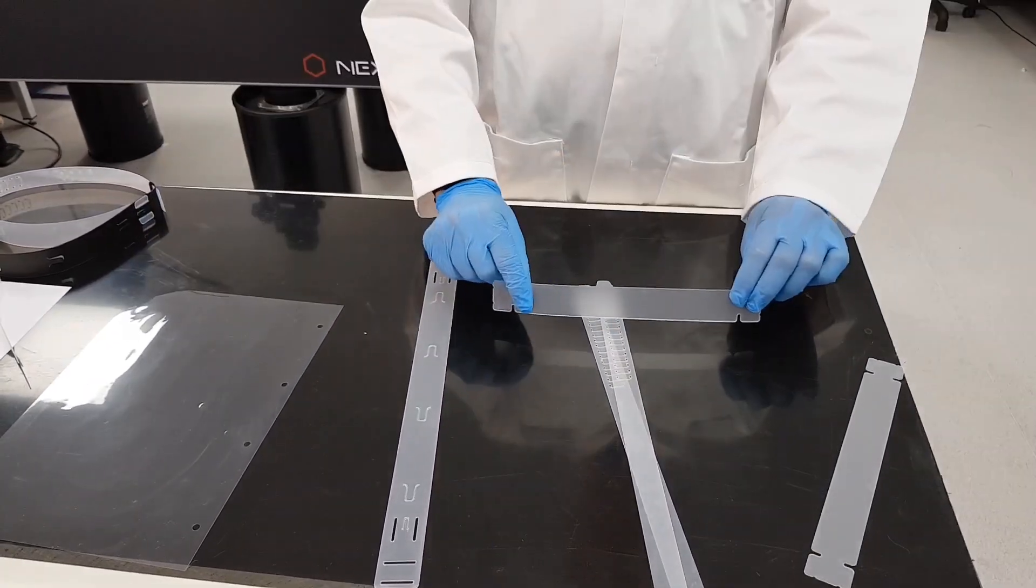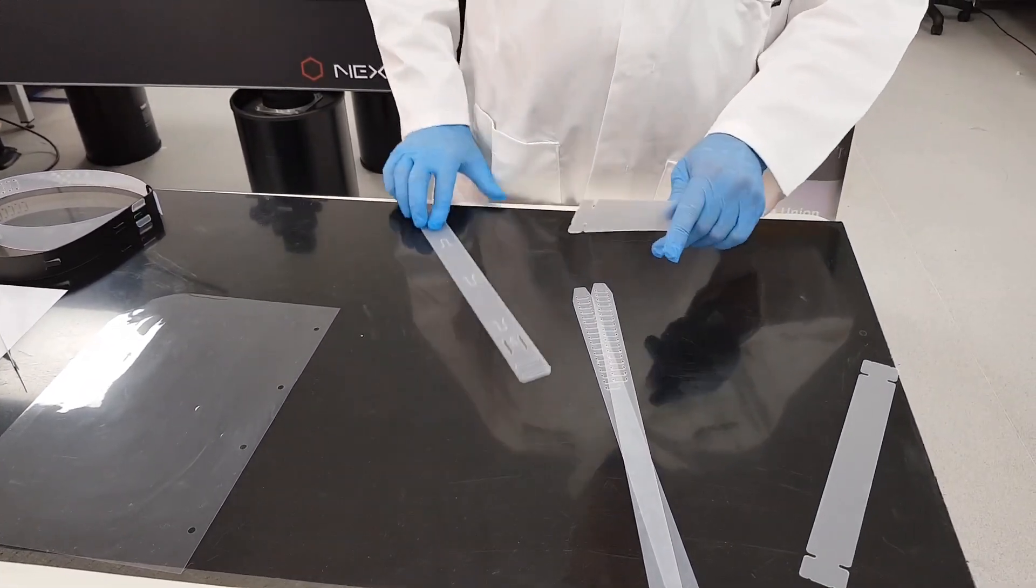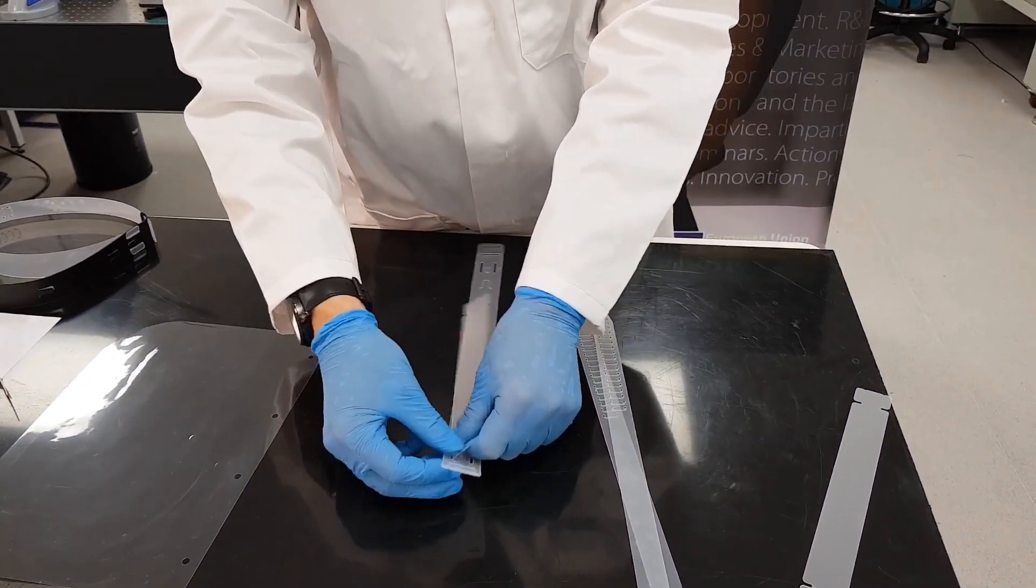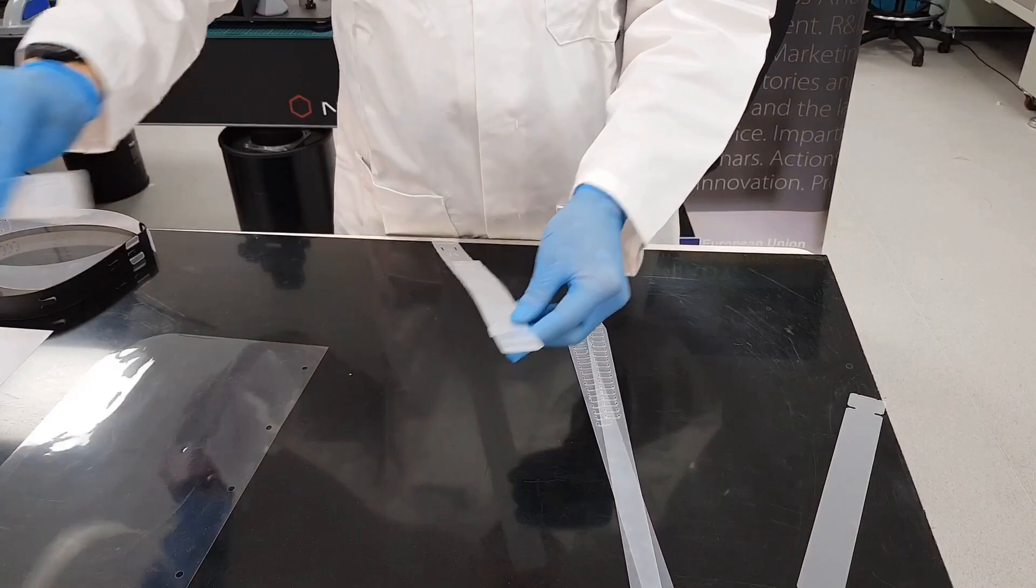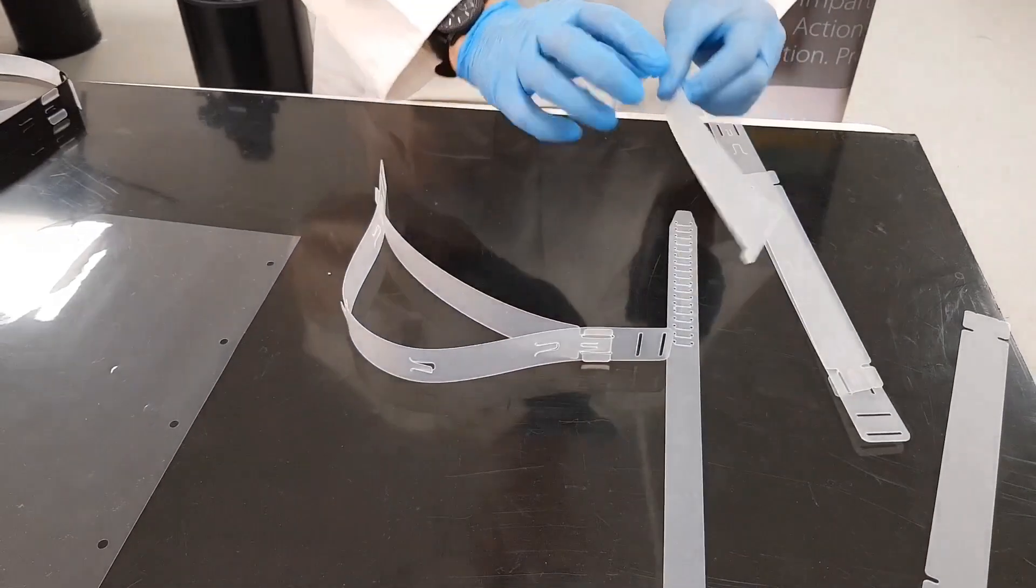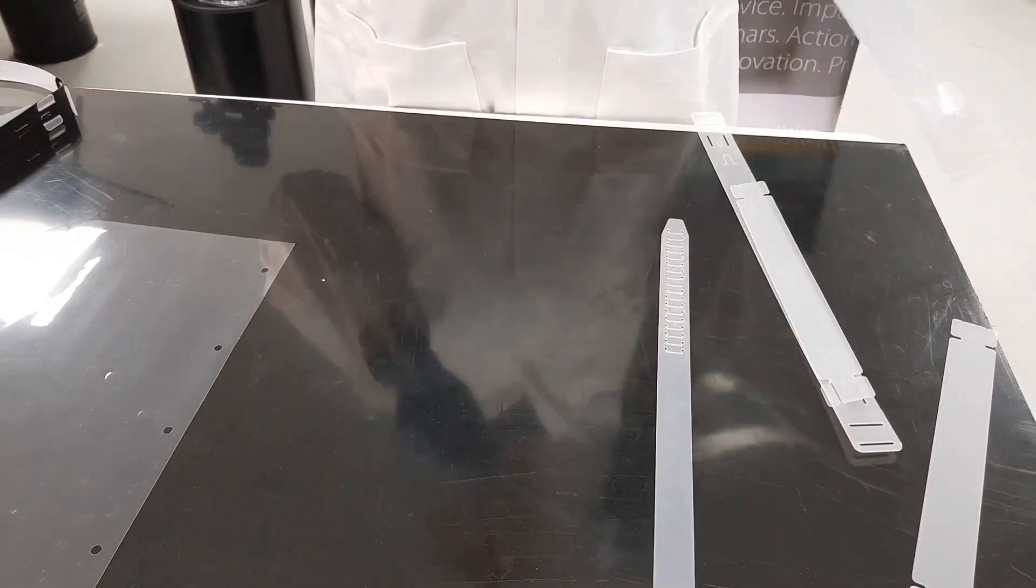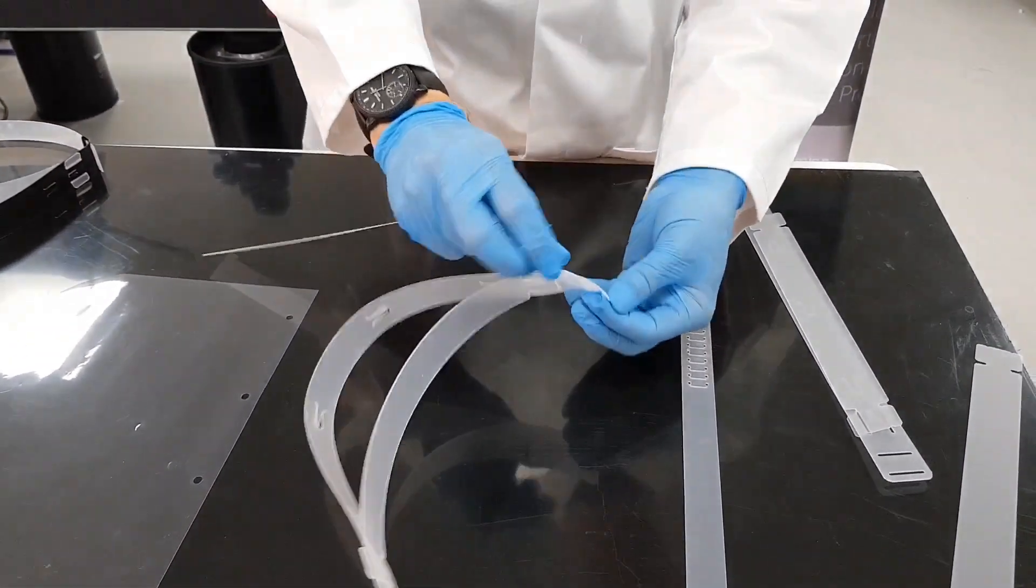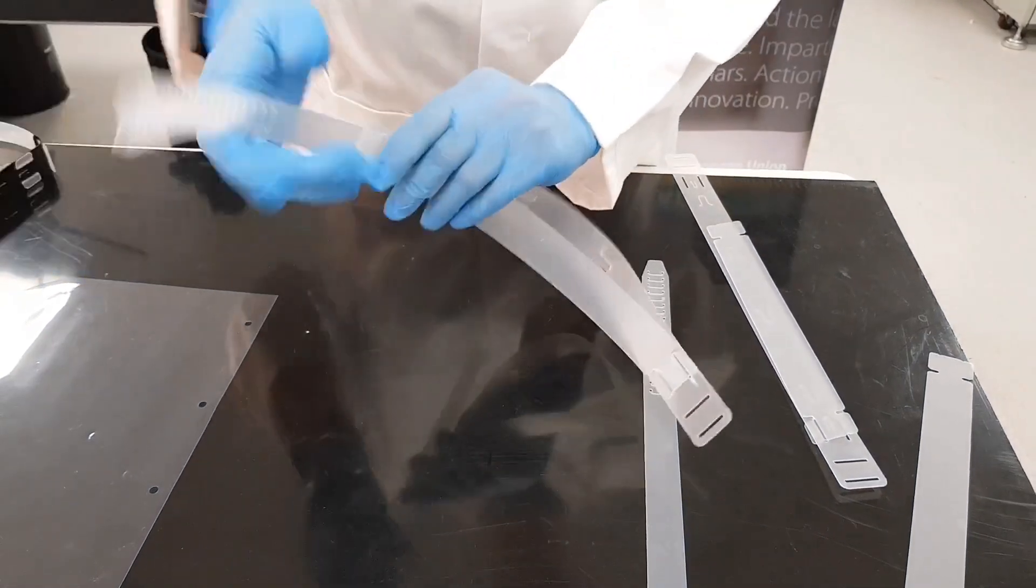Take the headband and the fixing strap. You insert the first part into there and there like so. Once you've done that, take the fixing strap and feed it through the two slots that are there. This can then be adjusted to suit any size.